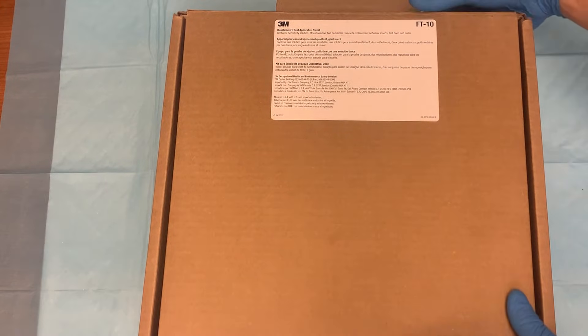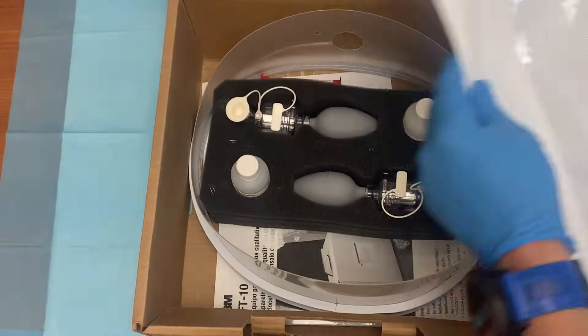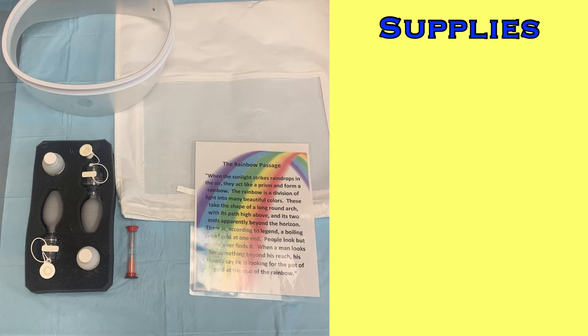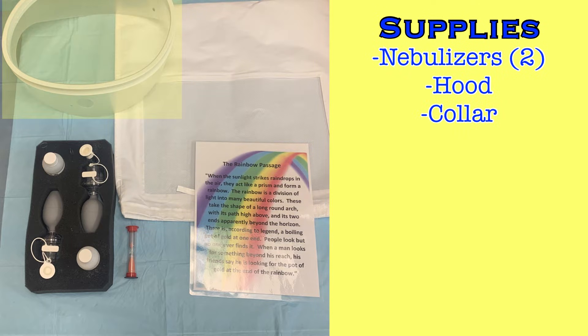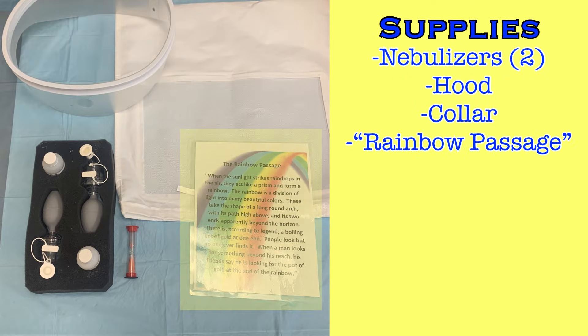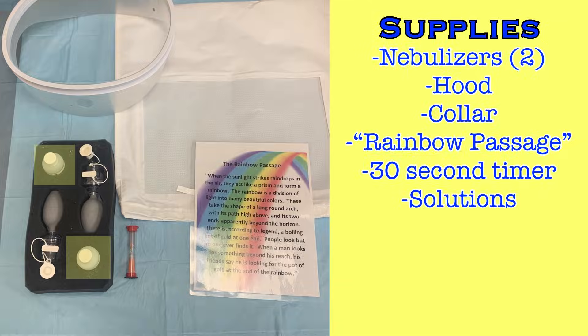Before performing a fit test, gather the necessary supplies. You may have a 3M fit testing kit that contains everything in one box, or you may have to gather your equipment separately. You will need two nebulizers, a fit test hood and the collar that the hood will attach to, a copy of the rainbow passage, and a timer. A 30-second egg timer will be utilized in this video, but anything able to show the passing of 30 seconds will work.